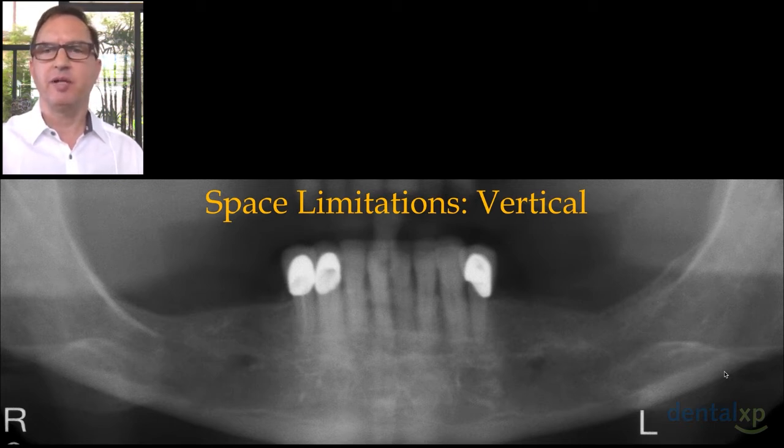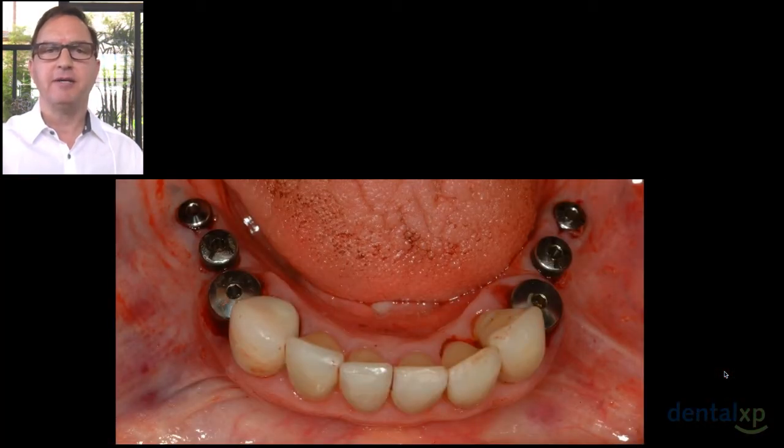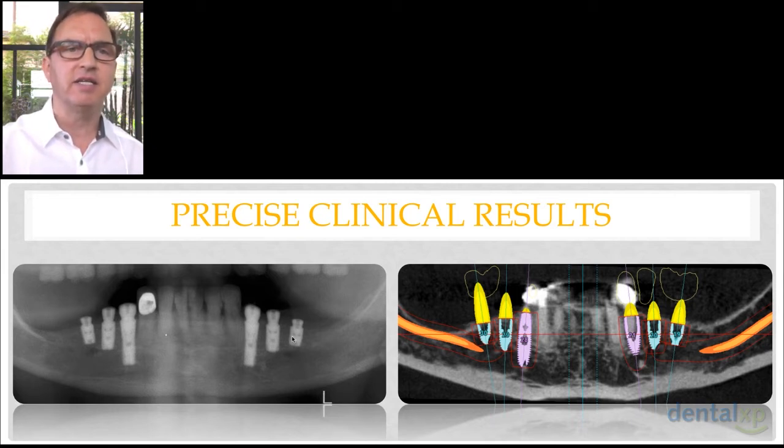As you can see, multiple implants are placed in the mandibular posterior area. As they are placed, you can take advantage of the opportunity to achieve good spacing and accomplish precise clinical results. What I'd like to draw your attention to is the implant in the area of number 30. It has an intended slight distal inclination, and it's resting in its final intended position just above the inferior alveolar nerve near the mental foramen. And that's true on the patient's left side of their mouth as well. And that is exactly as we had intended and planned.